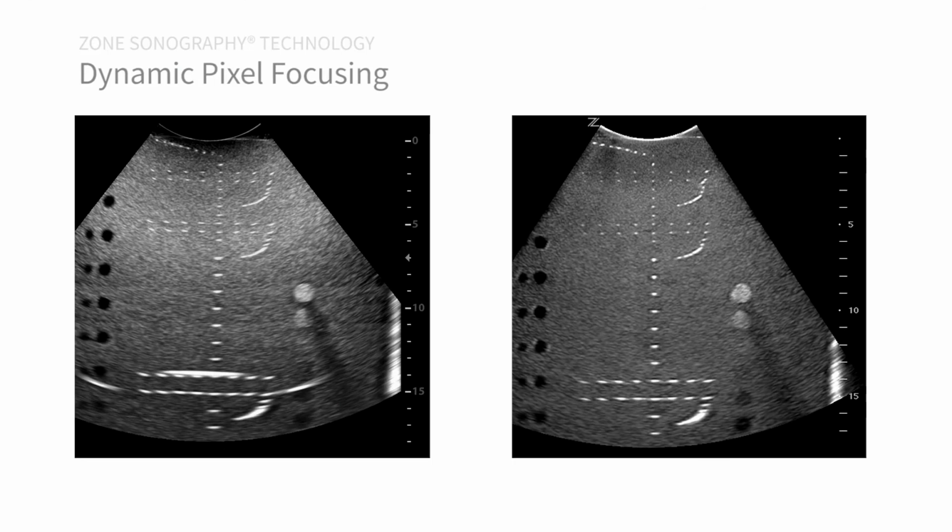Dynamic pixel focusing is demonstrated in this image of a soft tissue phantom. The image on the left was obtained using a traditional beamforming ultrasound platform with a single fixed focal zone. In the near field, the 1 millimeter pins are spatially resolved in both lateral and axial dimensions. As we move deeper into the image, lateral resolution begins to degrade, and the 1 millimeter pins begin to take on a splayed appearance until in the far field they are not recognizable as pins at all.